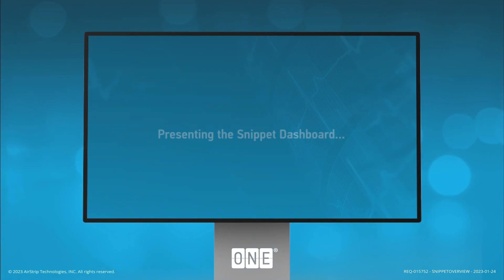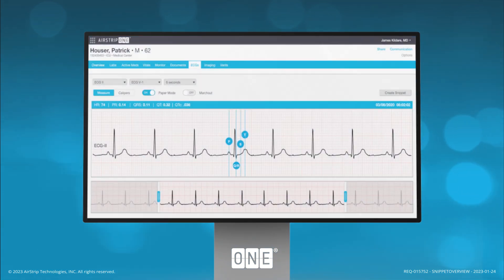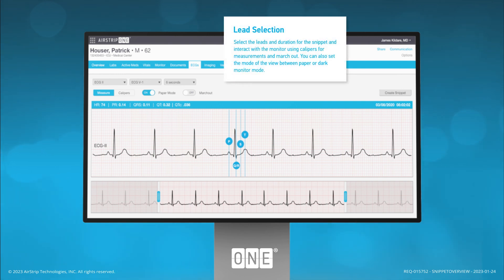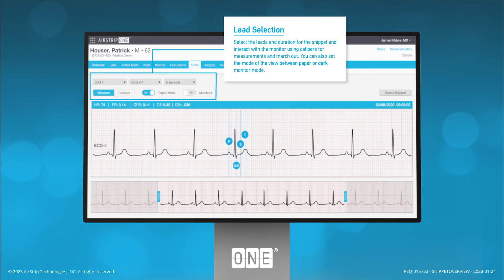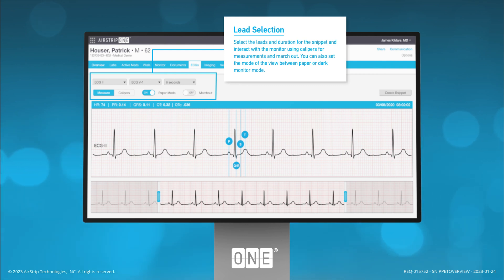The ECG technician has at their command a robust suite of features designed to produce actionable data fast. Lead Selection: select the leads and duration for the snippet and interact with the monitor using calipers for measurements and march out. You can also set the mode of the view between paper or dark monitor mode.